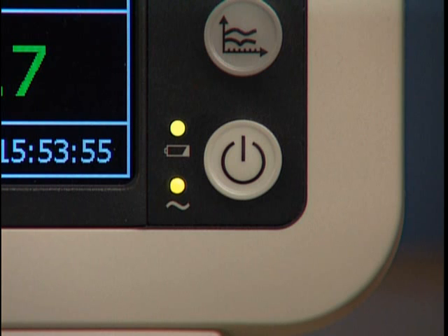Right now, the device is connected to AC power, as indicated by this LED. This is the charging LED, and it gives you information about the battery's charging status.